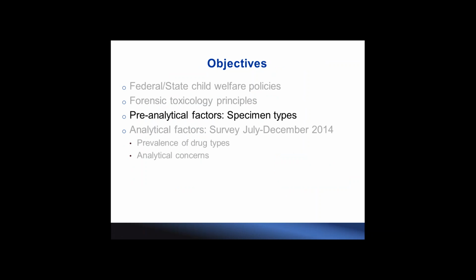So keeping the principles I just introduced in mind, I also want to remind you that I have mentioned earlier that interpretation of the test results is key to approaching forensic cases. And when we approach the case, we need to have a full picture of the case history, what exactly happened, other than receiving the test samples to analyze. And so the test results can only fit in this full picture to see if all those can explain the test results. So at the lab, there are also several factors we need to consider.